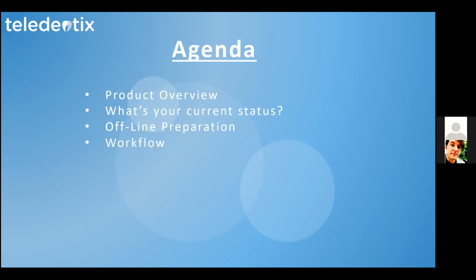Why are we reviewing this today? So we have a lot of exciting updates, enhancements that are here, and of course, the offline ability, which is the most exciting, specifically for all of you guys that go out into the field or go to homes or offices and provide these services on site. So we're going to go ahead and review that.